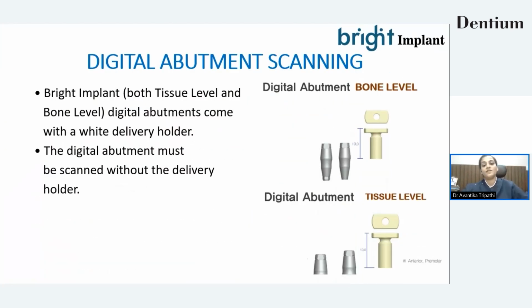There is a very, very important note to be mentioned in this digital abutment part: it comes with a white color delivery holder, which is not a scan body. Sometimes we feel like it looks like a white color scan body, but it is not. It has to be removed and then this abutment has to be scanned.